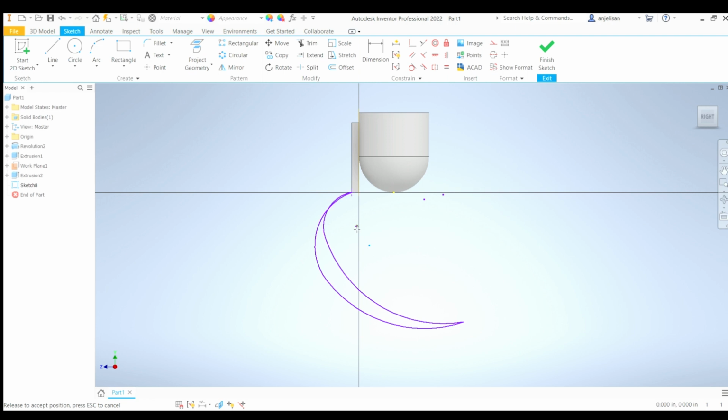You'll notice that I can also still modify this. It's not constrained or anything. So I can just click and drag the arcs as I like. Maybe I want this bigger, or taller, or smaller. Maybe I want it to be more rounded. Maybe I want this to go further to the right. I can edit this little point, just move it.